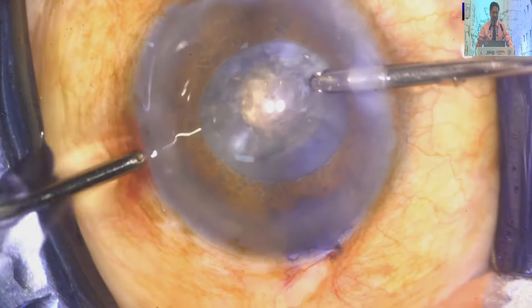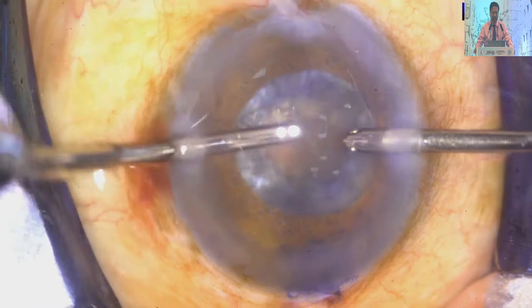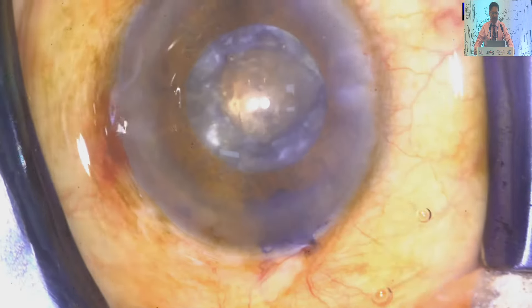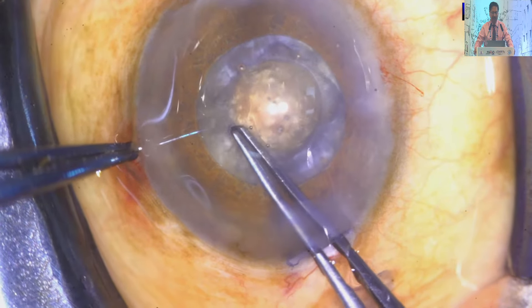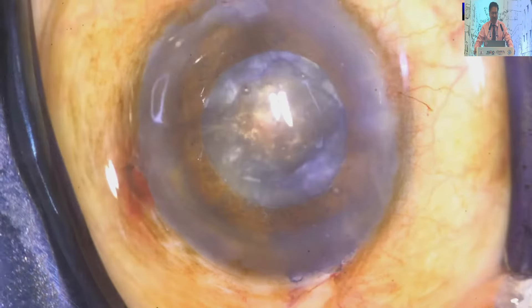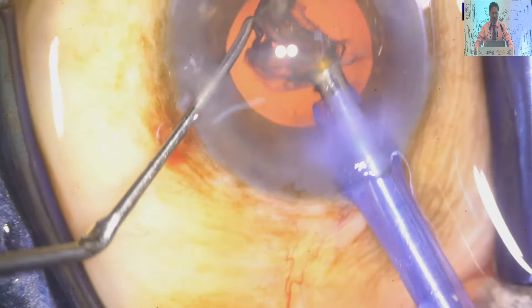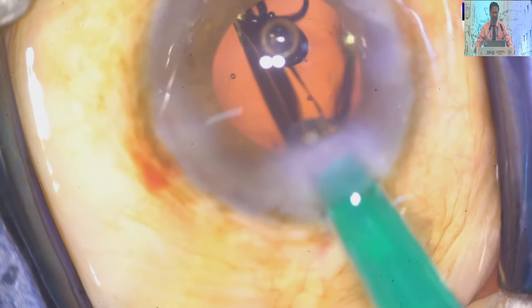Instead of a side-opening cannula, I have used an end-opening cannula so that cortical removal is easy. After decompressing, I just take the nick under viscoelastic and enlarge it to the desired size. So this is a two-stage capsulorhexis — very rewarding, very safe. For the last three to four years I have been following this technique without any Argentina flag sign.